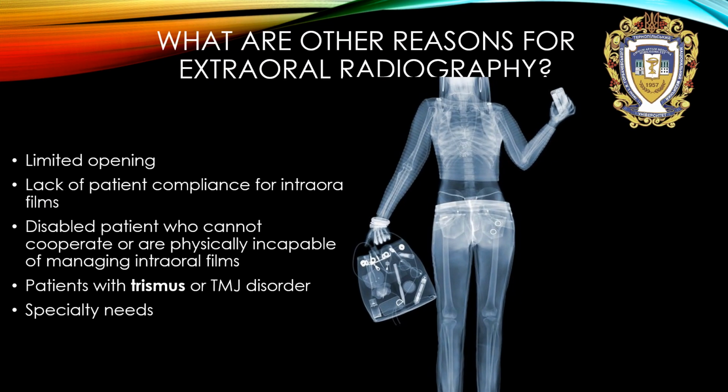But what are other reasons for extraoral radiography? Limited mouth opening. When it is impossible to put film or sensor inside of oral cavity, we can use extraoral X-ray.